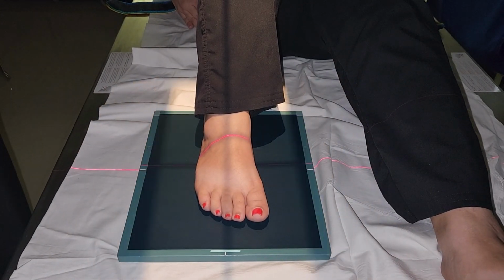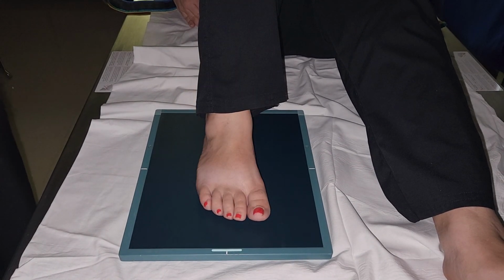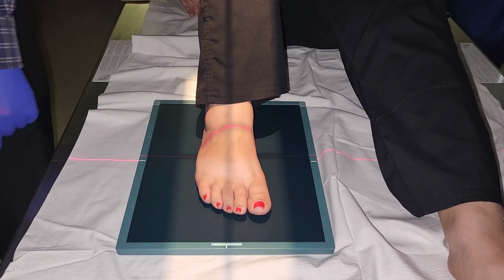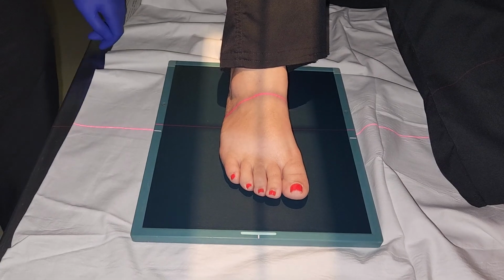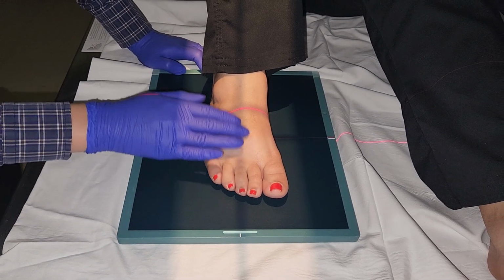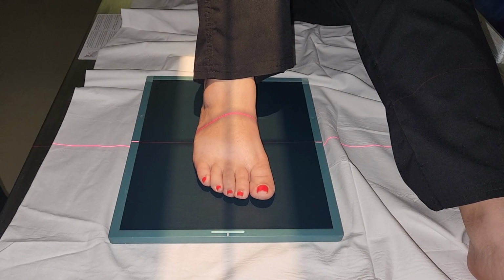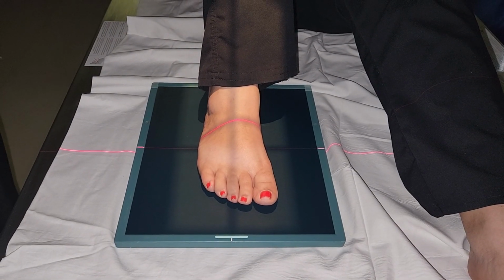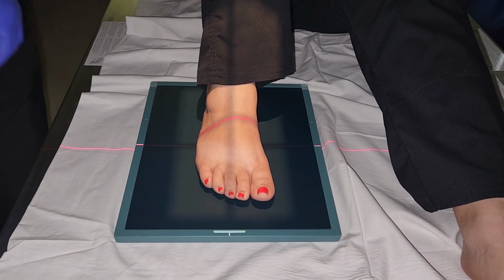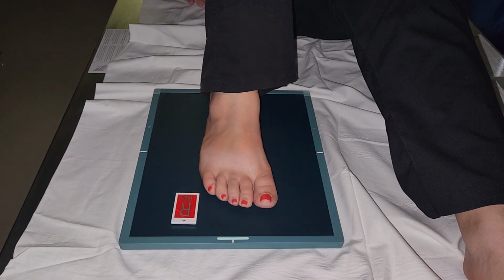Is it better to start with your collimation open so you can see it? Yes, I like to start my collimation open because I just realized, when the patient was moving, it lost my centering on the IR. With digital collimation, your tech may not do it. That's on them. I don't grade them anymore, but I do grade you, so make sure you do properly center. Okay, so marker. And that is our AP foot.